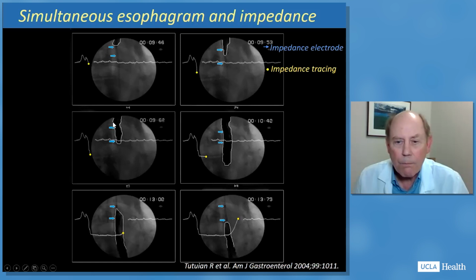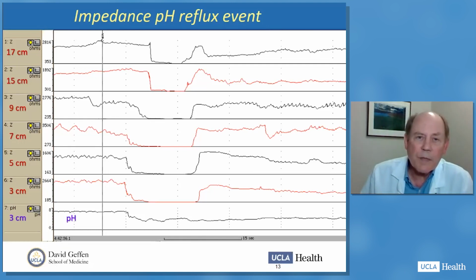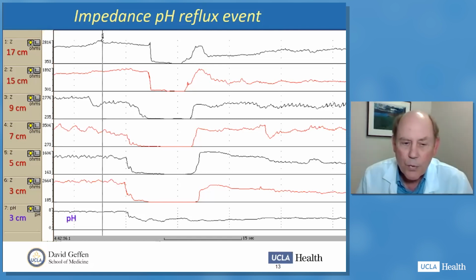When it contacts both electrodes and stays in contact with the electrodes, we're at our low point in the impedance. And then as the bolus passes, losing contact with this upper electrode, the impedance starts to go back up and then goes back to baseline when the bolus has lost contact with both of the electrodes. So if you look at an impedance tracing, and probably many of you have, this is sort of the ideal study. Doesn't always look this pretty.